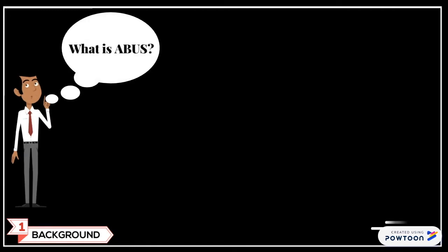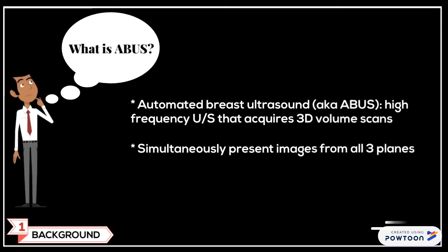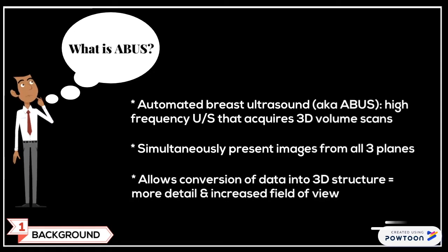What is ABUS? Automated Breast Ultrasound System is a high-frequency ultrasound system that acquires 3D volume scans. The monitor displays images from all three dimensions simultaneously. The data is then used to develop 3D structural representation, which provides more detail and increased field of view.